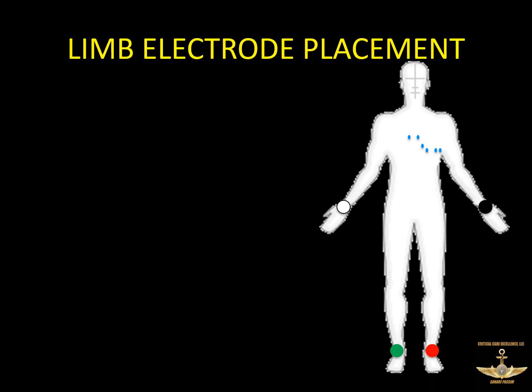Now understand that throughout the rest of the presentation, I may use the word electrode and lead interchangeably, but understand that electrode is the physical place from which you are gathering this information, so it's going to be where you put your little sticker. Whereas the lead is the information that you assess on the printed EKG or on the screen that you're looking at. So lead 1, lead 2, things like that come from a certain set or a certain single electrode.